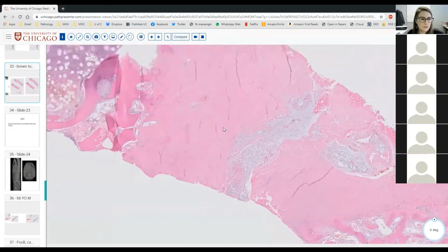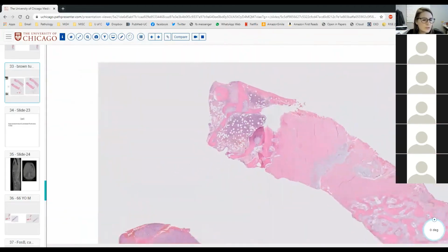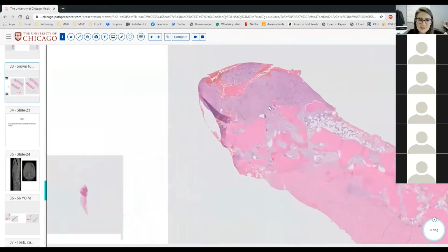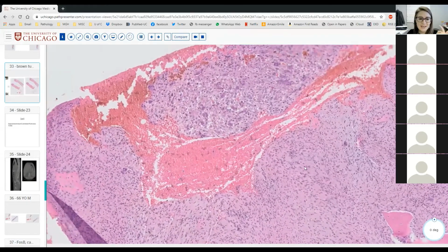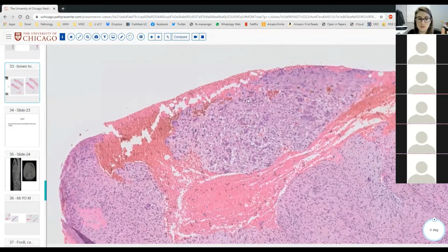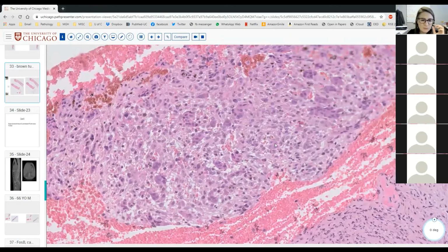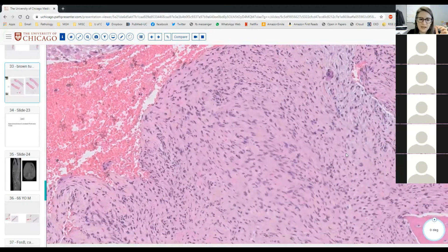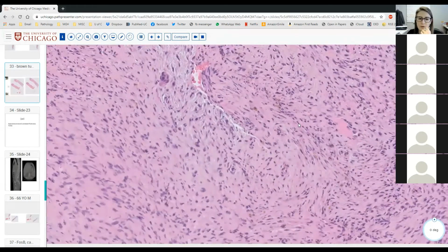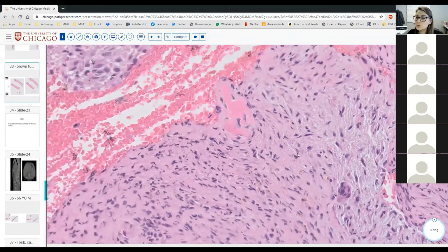of renal osteodystrophy. But then, that's just marrow. As we move to the actual lesion in this case, you can see that it looks nearly exactly like that prior case and nearly exactly like an aneurysmal bone cyst, right? Where you have giant cells with intervening spindly mononuclear cells with blood-filled spaces, and with this very collagenous fibrocellular stroma with the brown, right, coming from the hemosiderin, coming from the hemorrhage, coming from the pools of blood, okay?